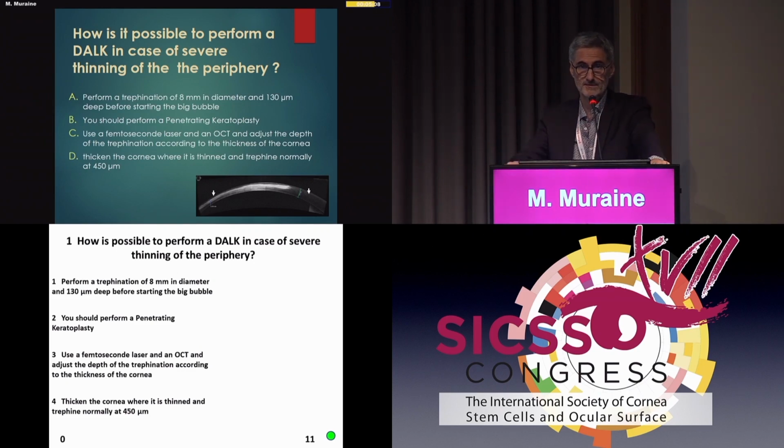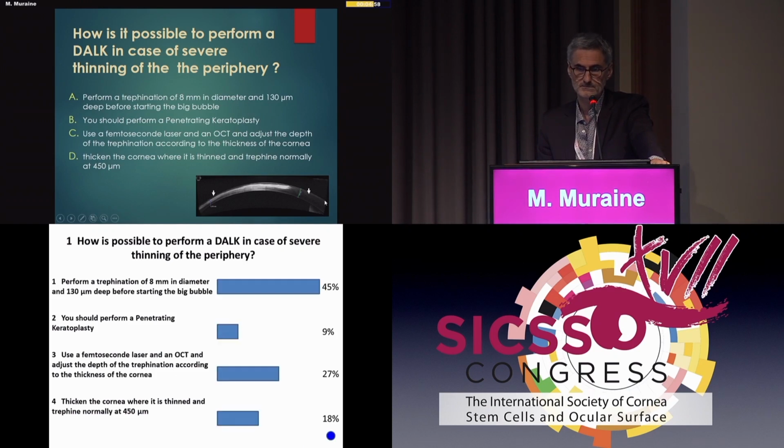Maybe there are several other solutions, and in this case I will show you the one that I chose. A small trephination is very difficult for obtaining the big bubble technique, or if you just have a very superficial trephination.